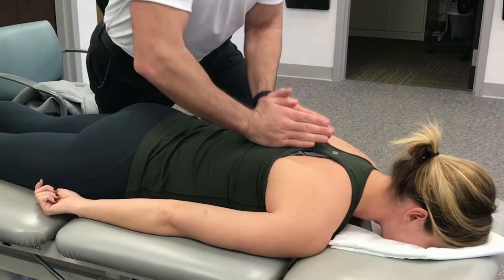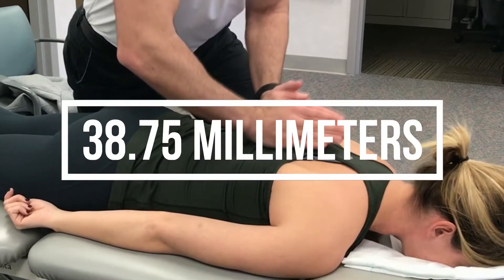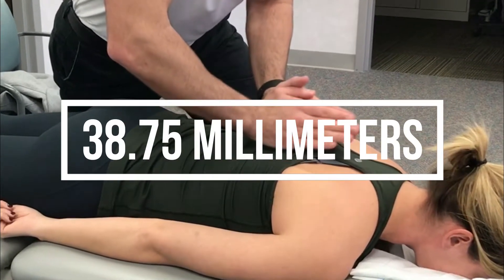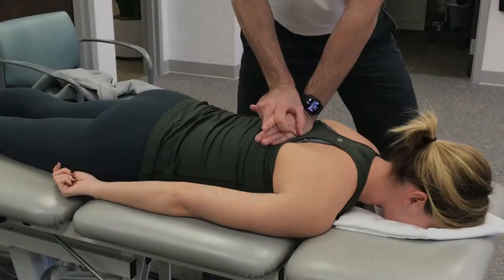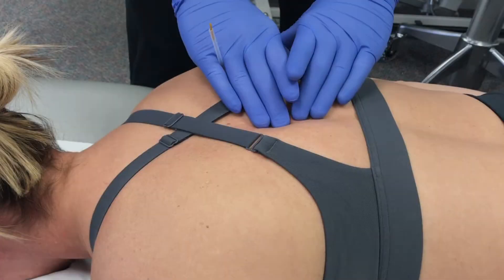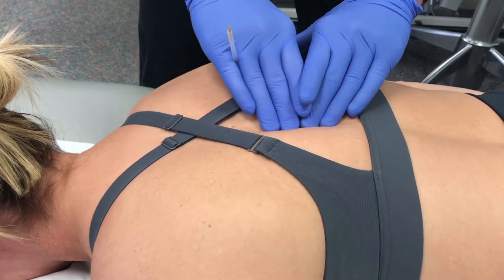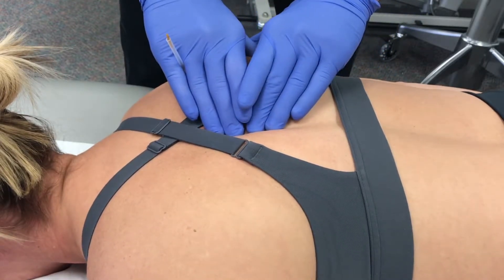During spinal manipulation to the thoracic spine, the authors found that during one thrust technique the skin moved about 38.75 millimeters on top of the underlying bone, and during another technique it was 33.25 millimeters. You can see in this video that the skin has quite a bit of play in the thoracic spine, and you can use this to your advantage to hit multiple levels without having to do a separate needle insertion in a nearby segment.